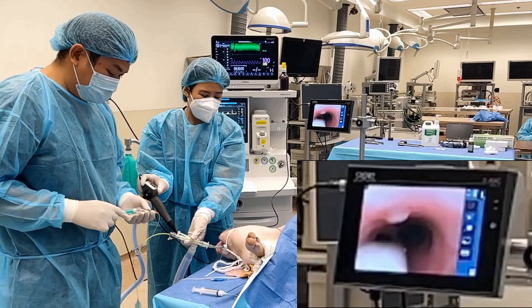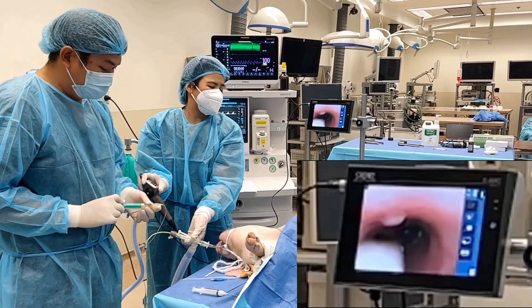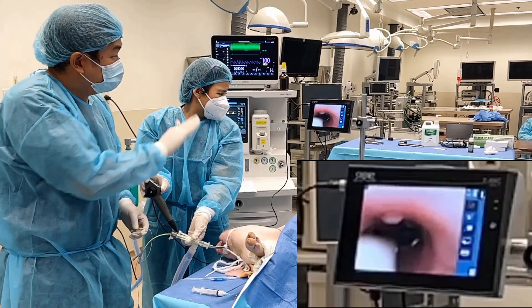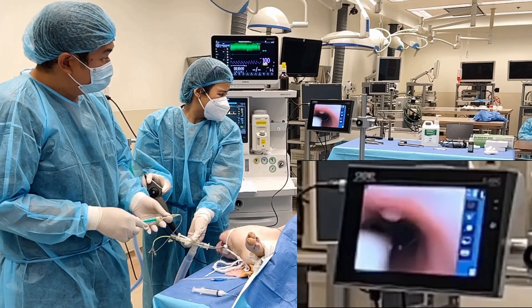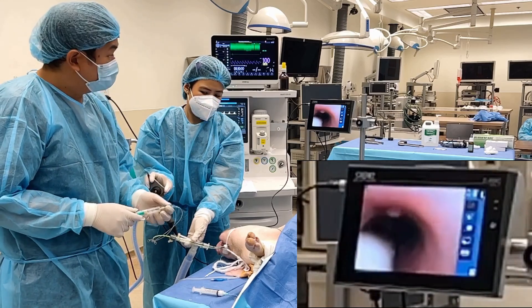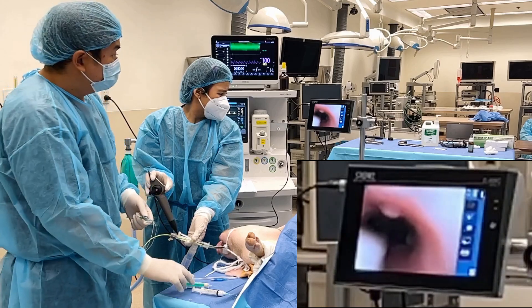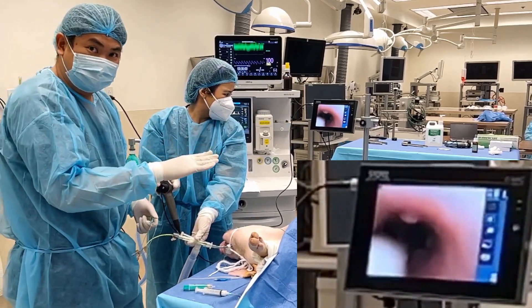If you want to isolate the right lung, inflate the right cuff. You can see the right lung is now occluded. If you want to isolate the left side, choose the blue one and inflate the blue cuff. You can see the blue cuff is inflated and you've isolated the left lung.